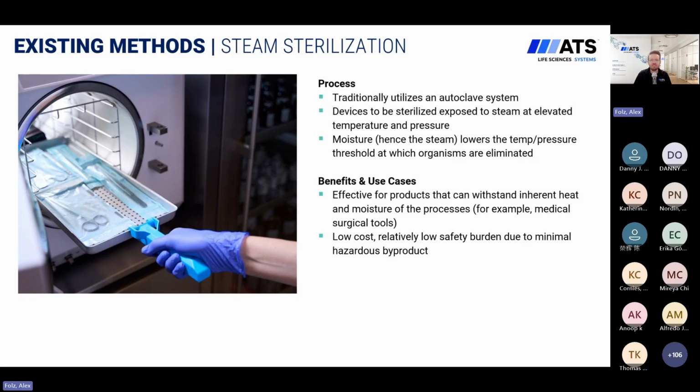Some other advantages of steam sterilization: it's a lower cost sterilization method, and there's a relatively low safety burden. There are some risks inherent to who is directly operating the system, but there aren't any nominal hazardous gases, off-gassing, radiation, and so on and so forth. So among the overall modalities of sterilization, it's a relatively low safety burden.